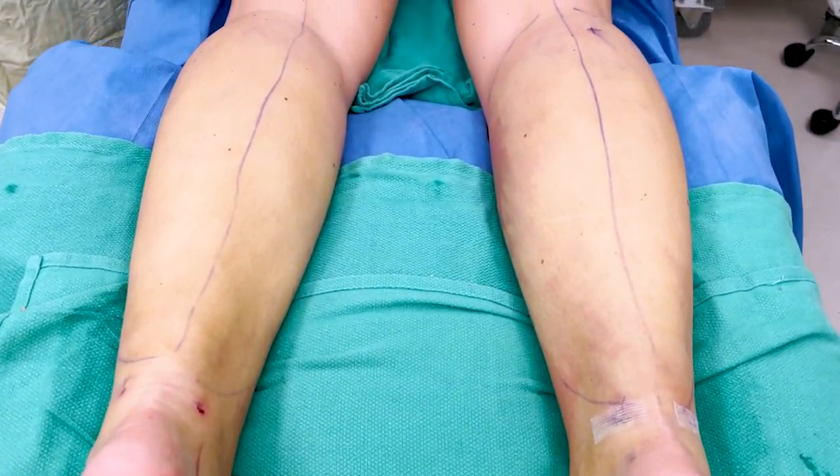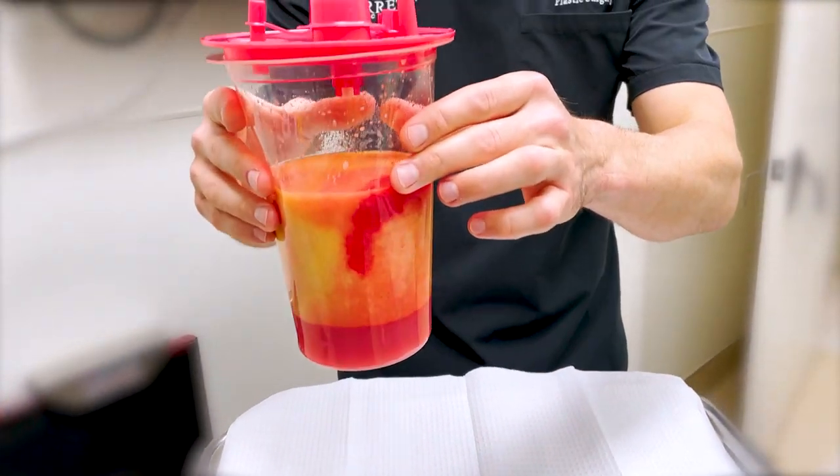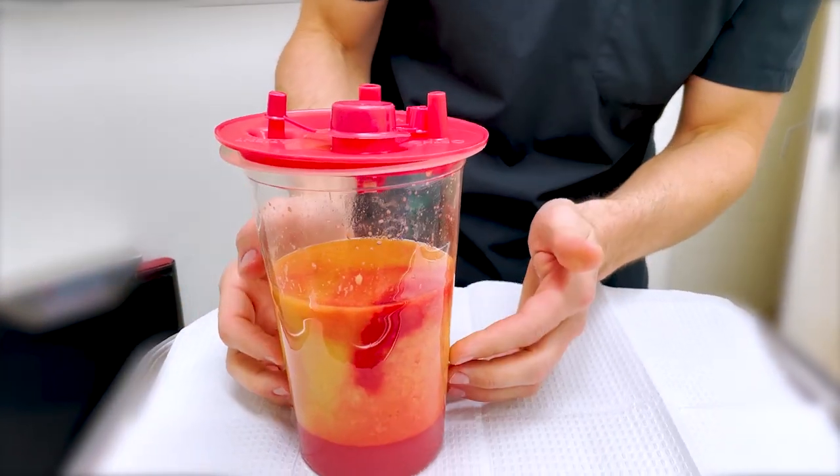That's it for a calf liposuction procedure. We did a high-definition calf liposuction as well as a safe liposuction technique. What that means is we gave our calves definition, in addition to doing a safer technique so that she doesn't get a whole lot of swelling and has a lower risk of compartment syndrome. This amount of fat is a record for us — this is all from her calves.